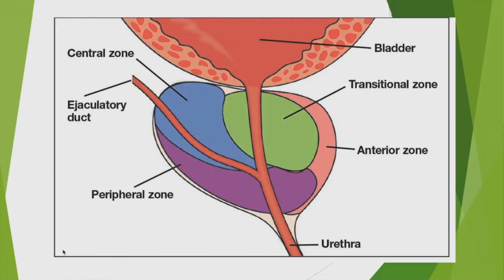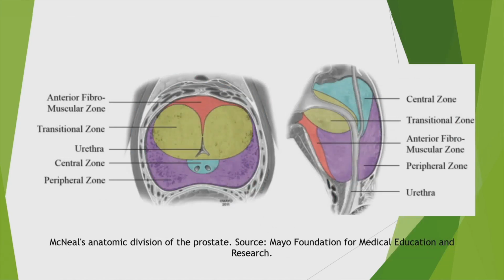When you simply scan your patient, you tell yourself, let's say I've located a cyst, where is it? Is it in the transitional zone? Is it in the central zone? It's always a bit tricky to find your way around. There are always differences between anatomy and echoanatomy. So I'm going to give you a quick rundown to help you move forward and make progress on prostate echoanatomy.